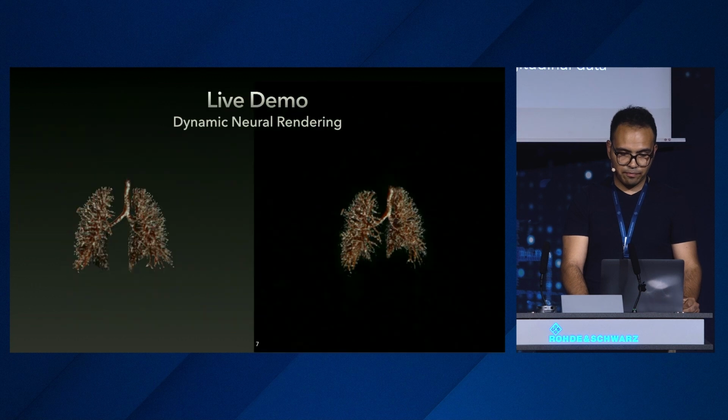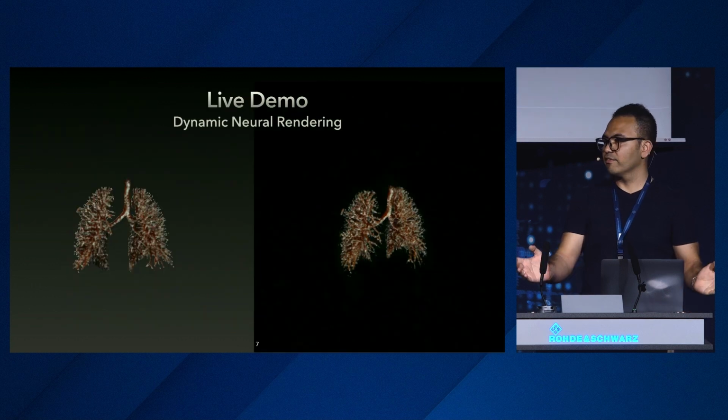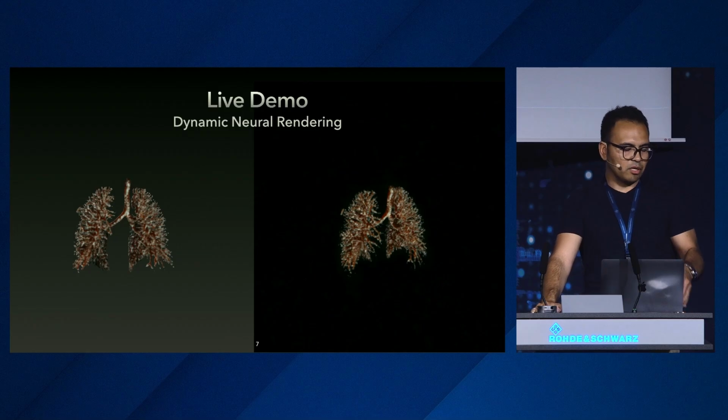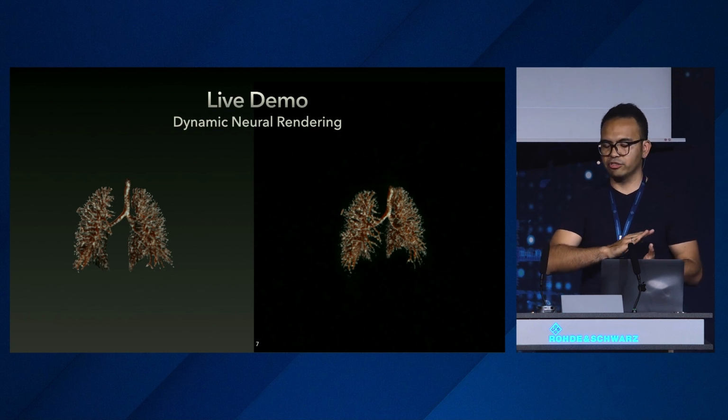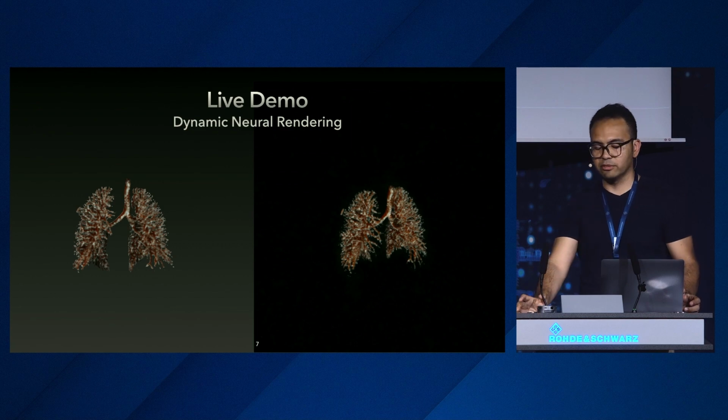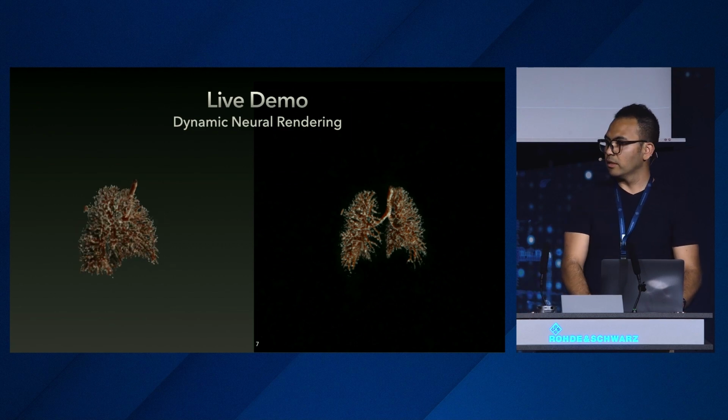Having said that, let's have a live demo all together, putting together everything that we've said. You're looking on the left side at the static view and on the right side at the dynamic view. I will play them in a minute. In principle, as I said, the system can be created for surgeons to pre-analyze before the operation or to analyze while operating, and then it has real-time constraints. So let's just play it once.